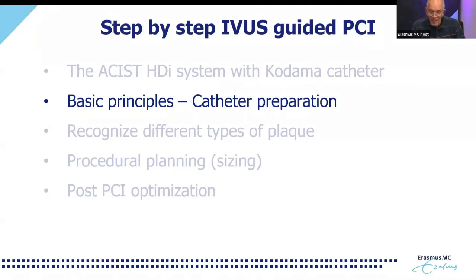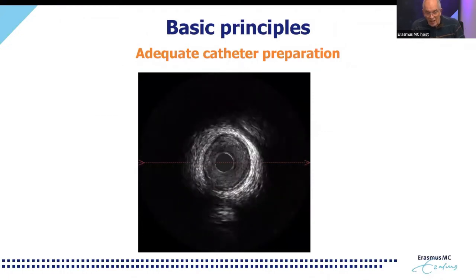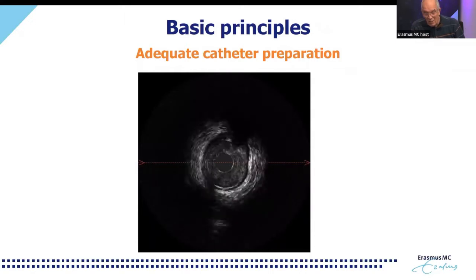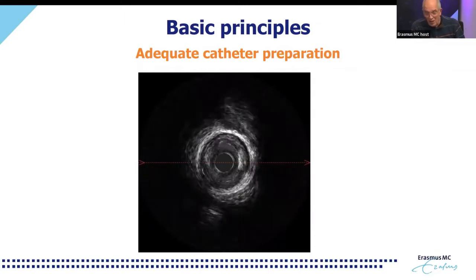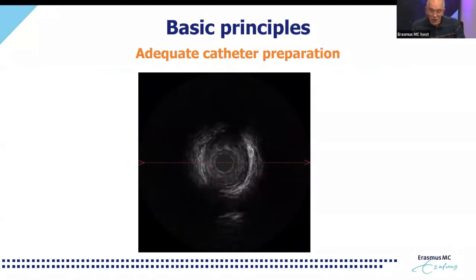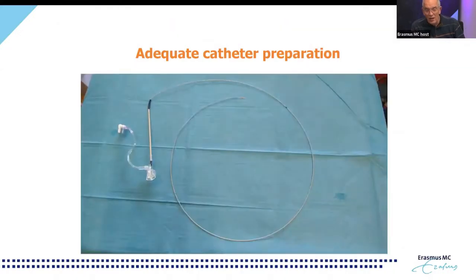If there is air in there, then you see, like in this movie, that the picture gets darker. And I can tell you, it always gets dark at the wrong moment, just at the spot you are interested in.